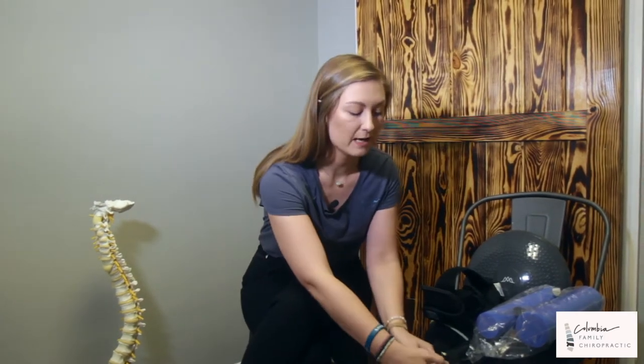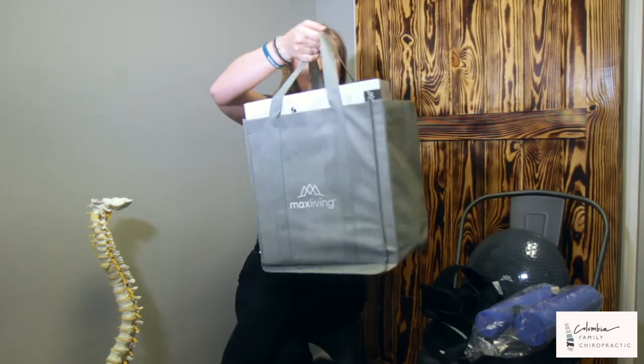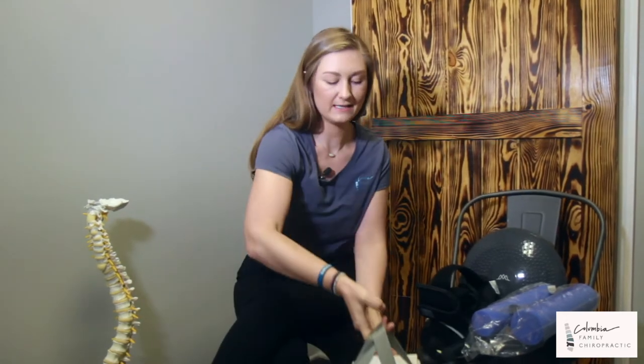Hi everyone. Today I'm going to be going over our home care exercise equipment in detail for you. First, I do just want to show you that it will be coming in a bag just like this. And the first thing that you will see is going to be a user manual, which will show you pictures of everything.